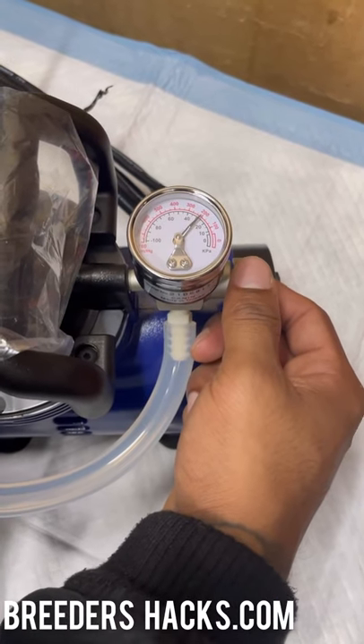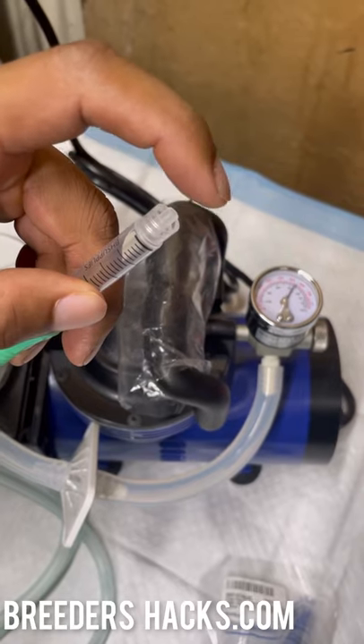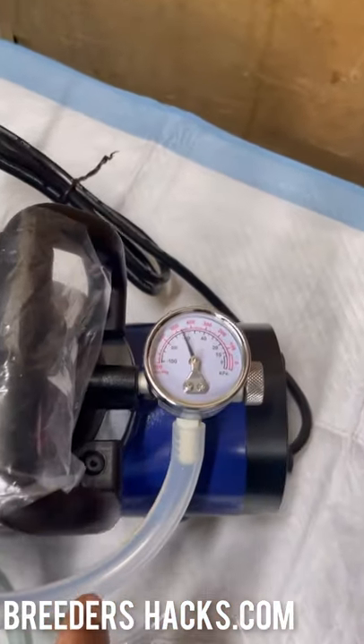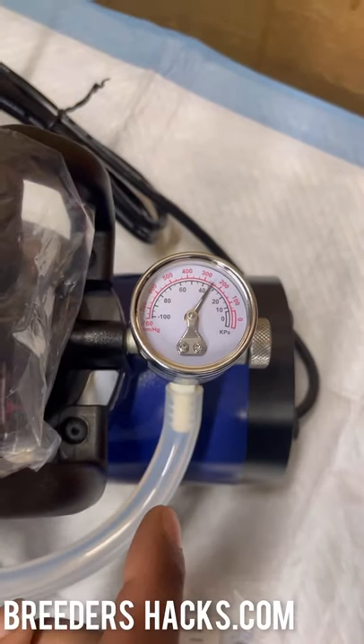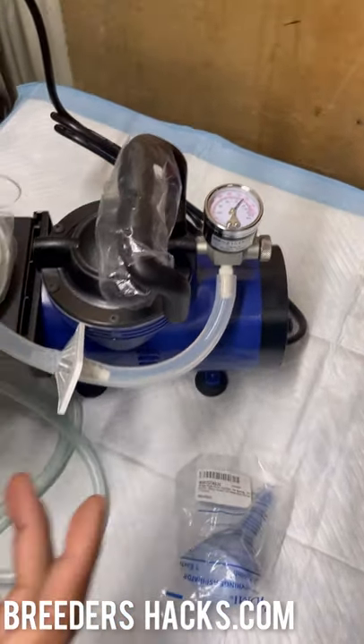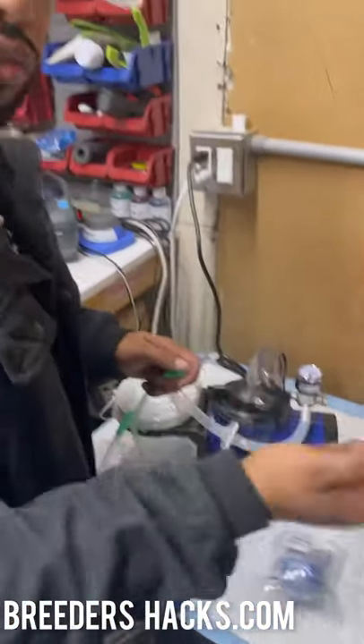As you can see, I'm putting my thumb on it and watch the pressure go up — see how high it gets. This machine can go up to around 30 pounds of pressure. It'll build up pressure and rip the mucus right out.